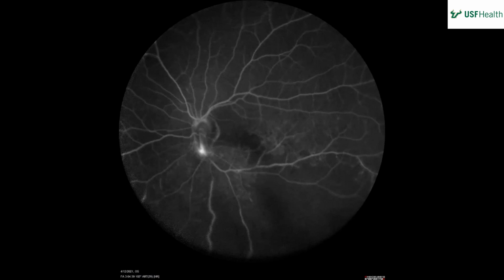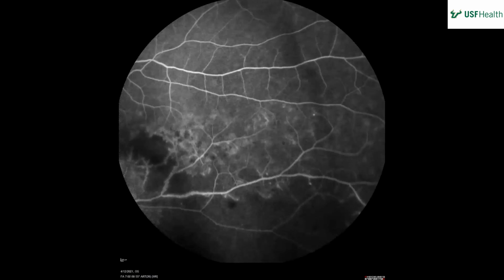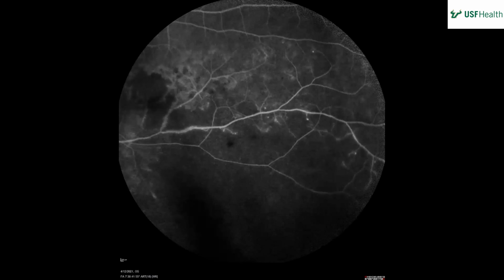The areas of what I assume to be hypoperfusion on the inferior area of the fluorescein angiography look to be starting to fill up a little bit, but that's probably just late phase, just general fluorescence. And just because we're used to it, we always call it non-perfusion. Hypoperfusion is probably more accurate, but we usually call it non-perfusion. There's that 7 minutes. There's quite a few of these photos. I can see little white dots near where maybe there's some leakage.